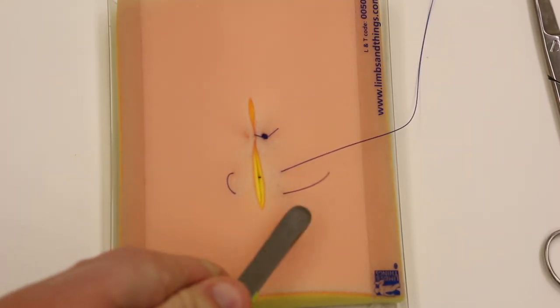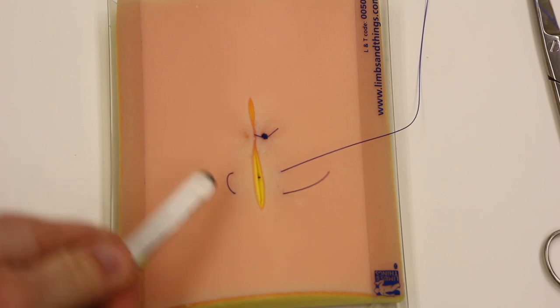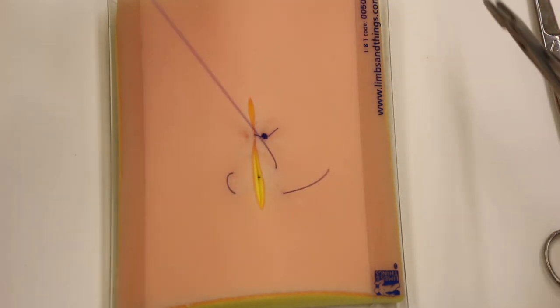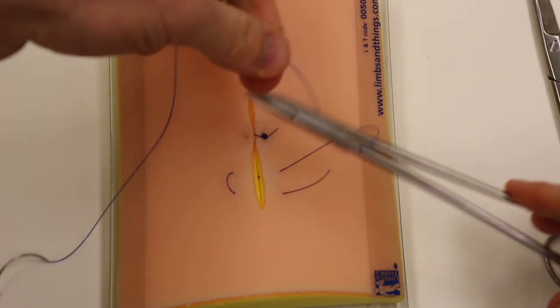So hopefully you'll see that we go in here, out here, in here, out here, making a little box. And it's just the same instrument ties before. So two wraps.